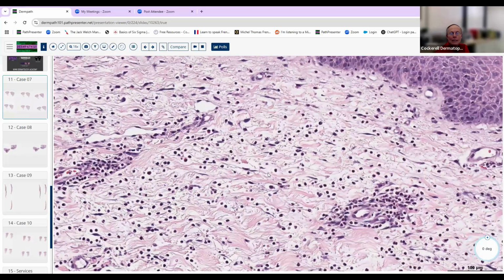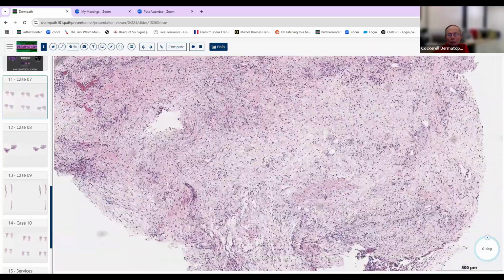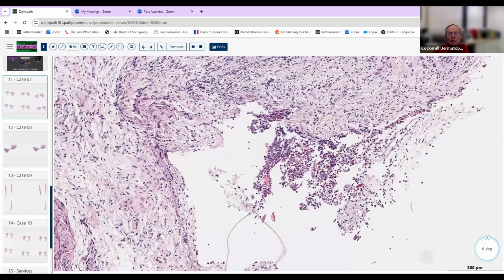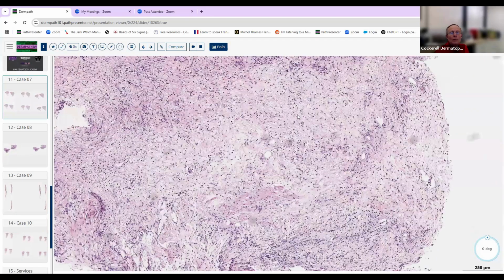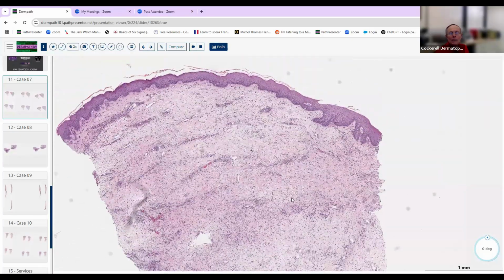these cells are neutrophils. And as we go to the other area at the very bottom of the specimen, we've got a collection of neutrophils. Basically, and again, this might have been a more nodular, round collection if we had maybe another section. So we've got almost a separate focus here, but a diffuse infiltrate of neutrophils throughout the dermis that we now can see at this higher magnification.